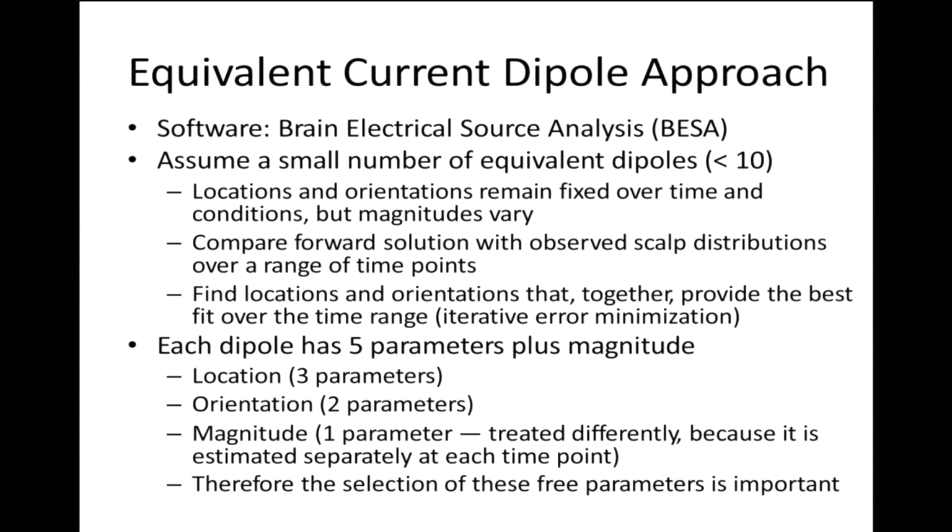So they left academia and founded a company called BESA, Brain Electrical Source Analysis, which started as very user-friendly software for source reconstruction, but later provided a host of EEG processing. Very expensive software, but okay. That's where they were before, in academia, and their approach is called the ECD approach.